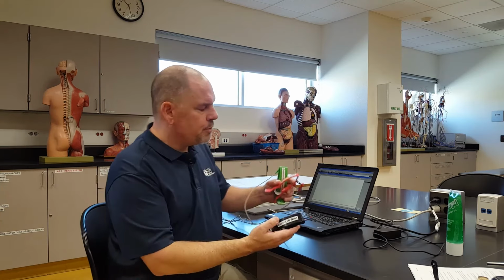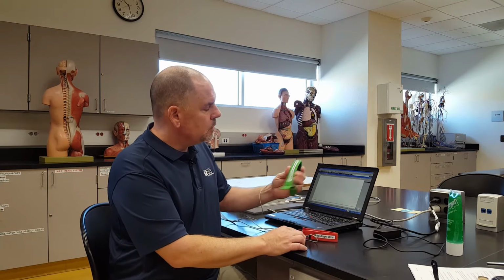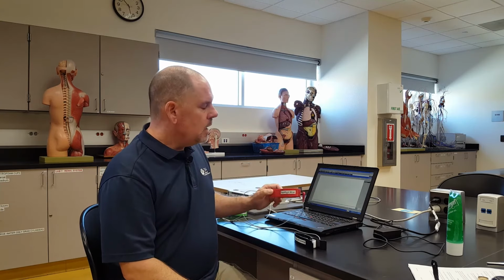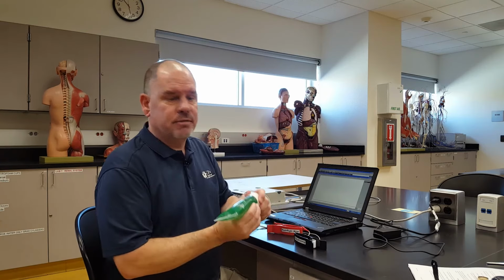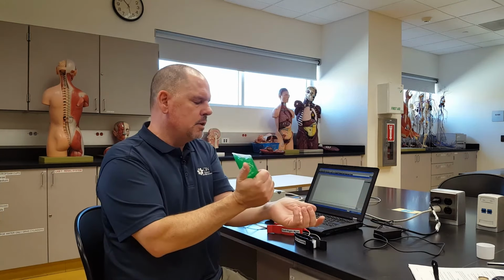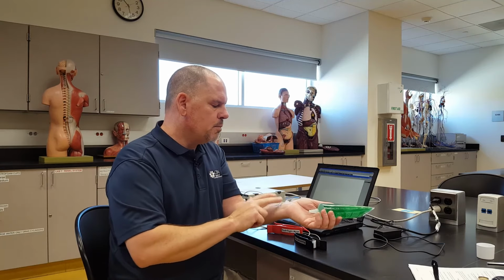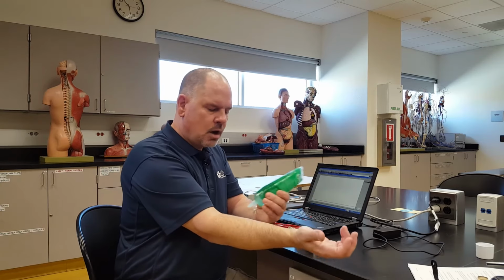We're going to use a simple 3-lead ECG: red, black, and green for ground. And of course, these clothespin leads, as they're called, are very easy to attach. So we don't get as highly accurate an ECG as you might at a hospital or a medical facility, but oftentimes we can get one that's good enough. I'm a big believer in the use of a good amount of electrode gel to produce, let's hope, a better signal from our ECG.